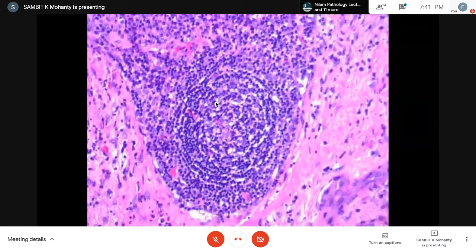This is the marginal zone, the mantle, and the follicular center. The mantle is always dark, to remember, for the neophytes in pathology. Mantle is the dark concentric area of cells. Marginal zones do have clear or eosinophilic cytoplasm. They are polyhedral to polygonal. They are about 2 times the size of mantle cells, and follicle cells are again bigger, intermediate. So the periphery, the marginal zone, is pale.